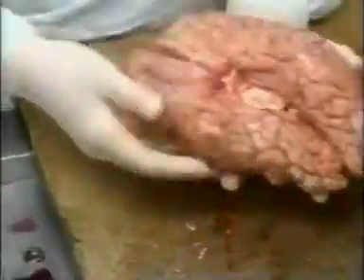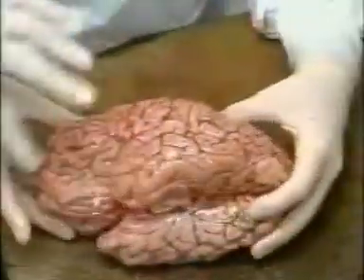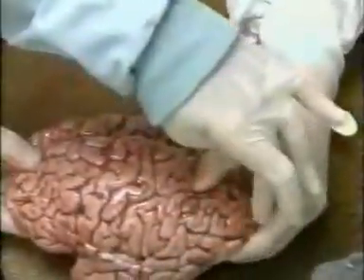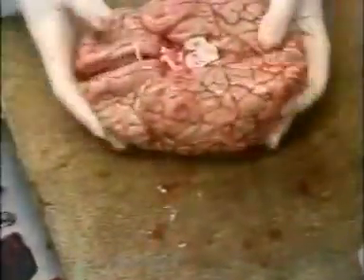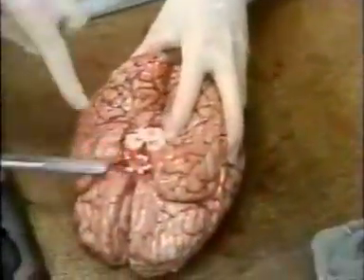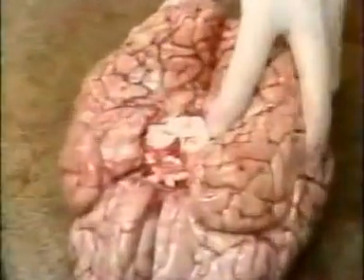These are the various lobes of the brain, the frontal lobes. These are the temporal lobes. This would be parietal and occipital towards the back. Now, those two small dots are called the mammillary bodies.